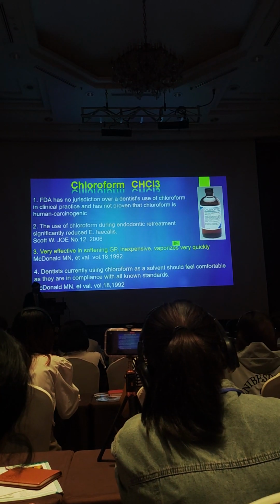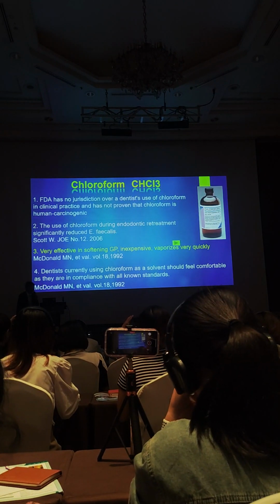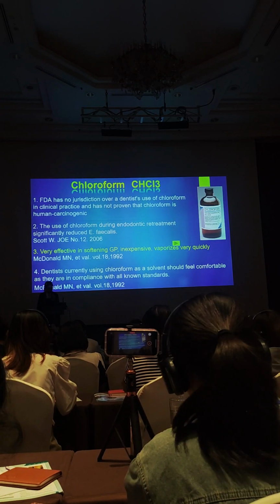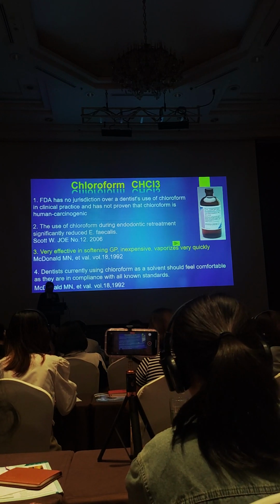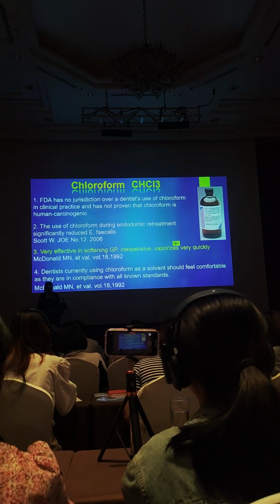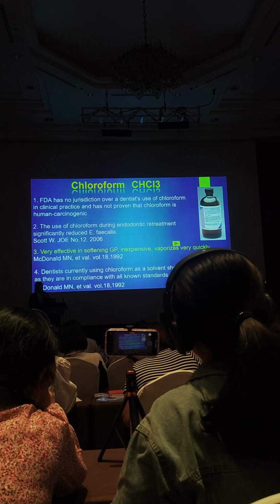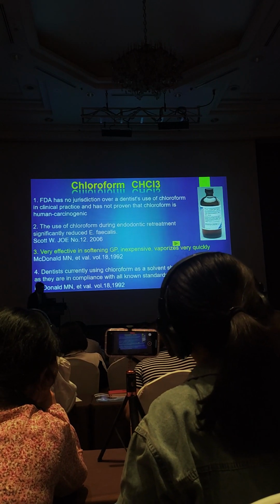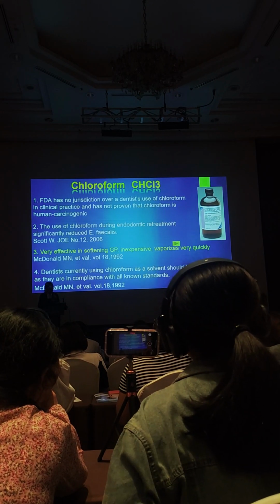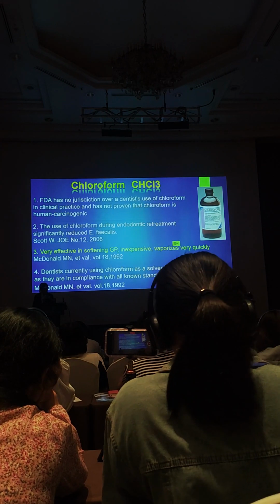In addition to that, I always use chloroform to dissolve gutta-percha. Many people consider chloroform carcinogenic or dangerous, but it's not dangerous. In the States, every university hospital has chloroform, and every endodontist in the United States has chloroform. So don't worry about it. The American FDA has no jurisdiction over dentists' use of chloroform in clinical practice and has not proven that chloroform is a human carcinogen.